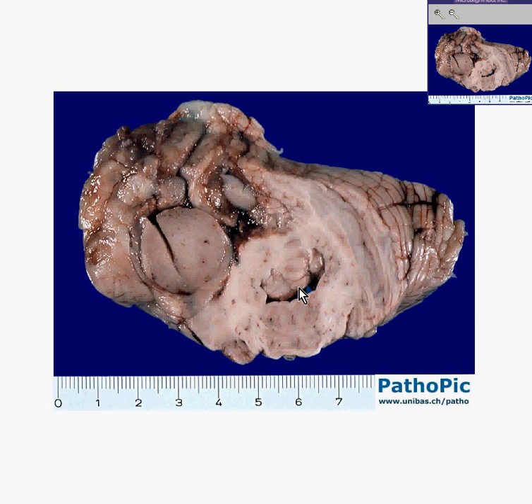Also note that this could very well be the fourth ventricle as well. Notice that at least half of this tissue here, certainly all of this tissue and all of this hemorrhagic stuff here, does not look like normal brain tissue, in which you could see demarcation between gray matter and white matter, which you could see along here. This is the brain tumor.